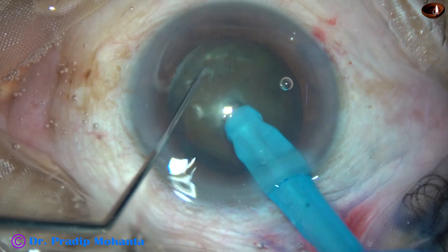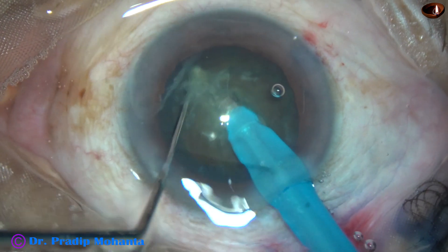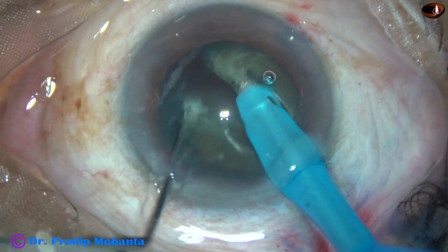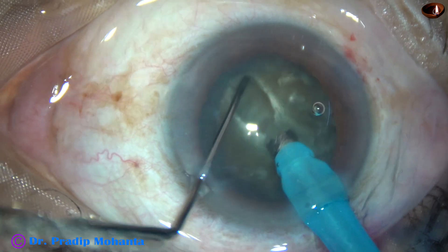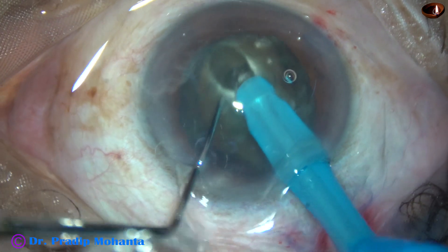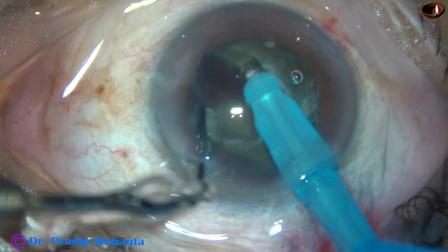The tip is buried into the substance of the nucleus. It goes through the substance of the nucleus towards the posterior equator. And a nice crack is obtained. It is rotated 180 degrees, and along the initial crack the two hemi-nuclei are completely separated.